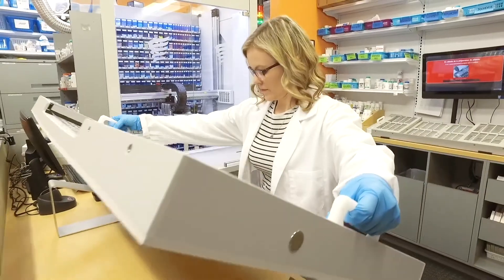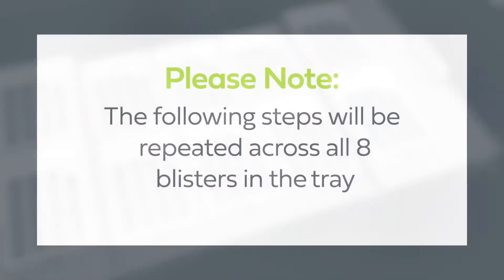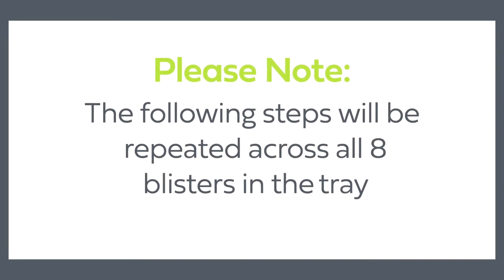When the filling process is complete, remove the tray as instructed to begin the sealing process. As you move through this video, please note the following steps will be repeated across all eight blisters in the tray.